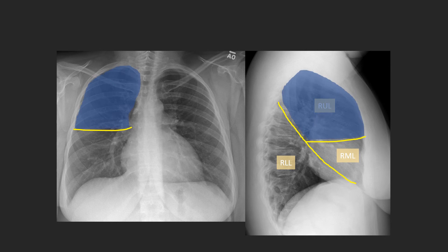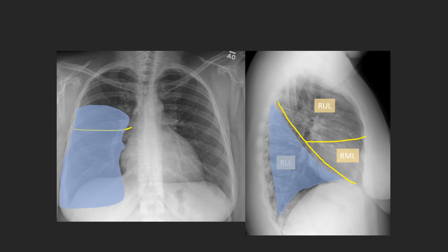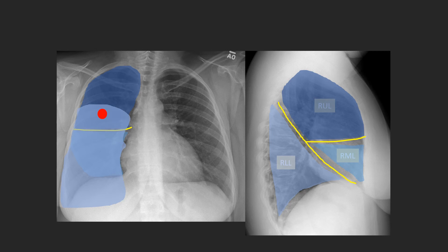The right upper lobe is always above the minor fissure. The right middle lobe is below the minor fissure and anterior to the major fissure, with a large surface of contact with the heart. The right lower lobe mainly contacts the diaphragm. On the frontal view, because of significant overlap between lobes, it can be hard to localize which lobe a nodule is in. For example, a nodule in the mid-lung zone could be in the right upper or right lower lobe — we need the lateral view to determine which.